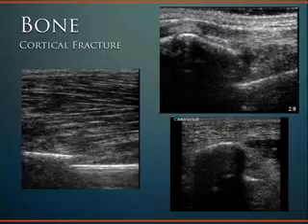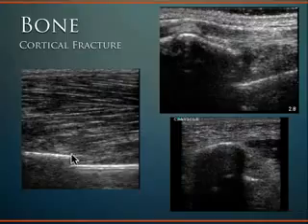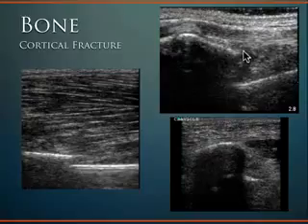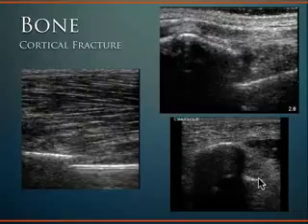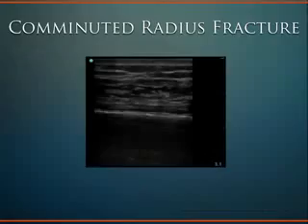it becomes quite obvious, where you have that discontinuity and what people refer to as step off when you're looking at fractures. It'd be nice if they were all this obvious. They're not always all that obvious when you're looking at that top right picture. And then this distal clavicle fracture, very, very common step off type appearance and displacement of the bony fragments.